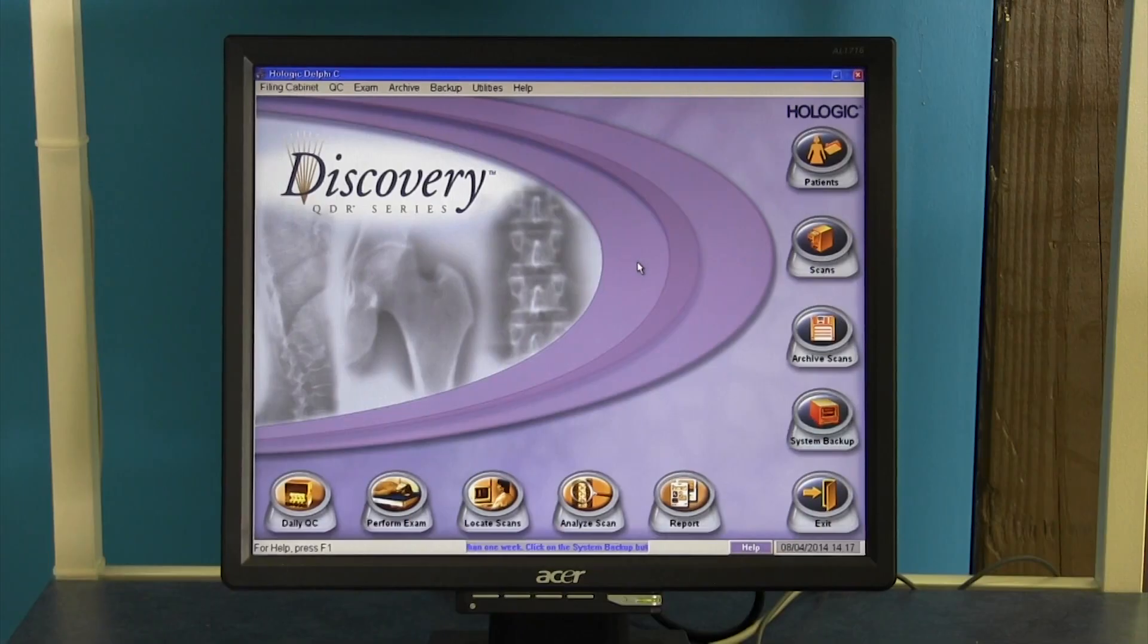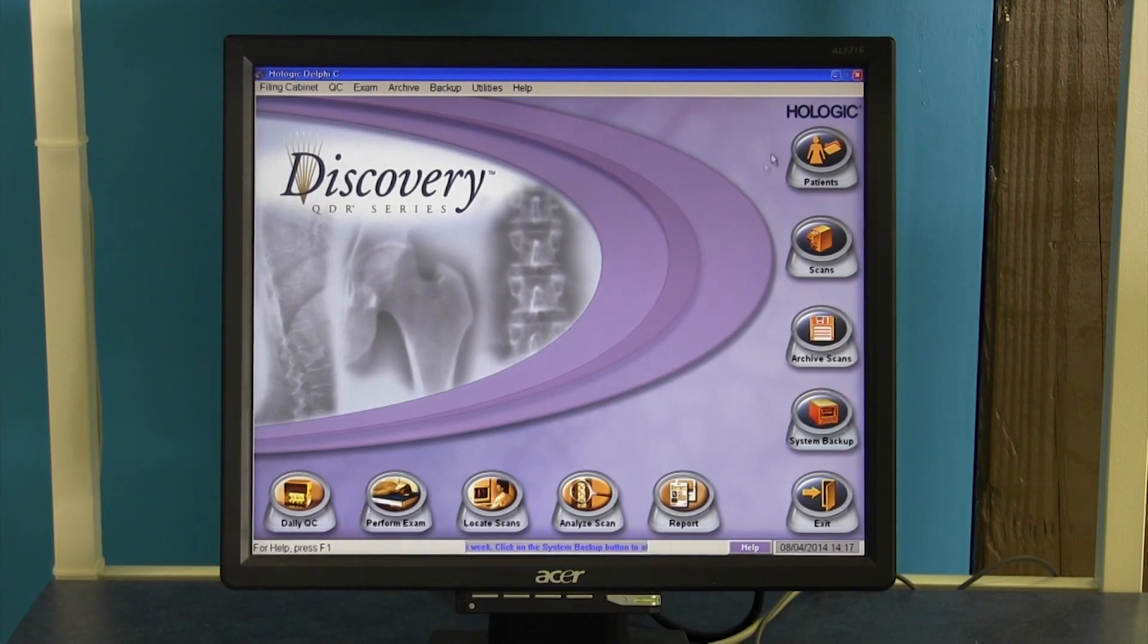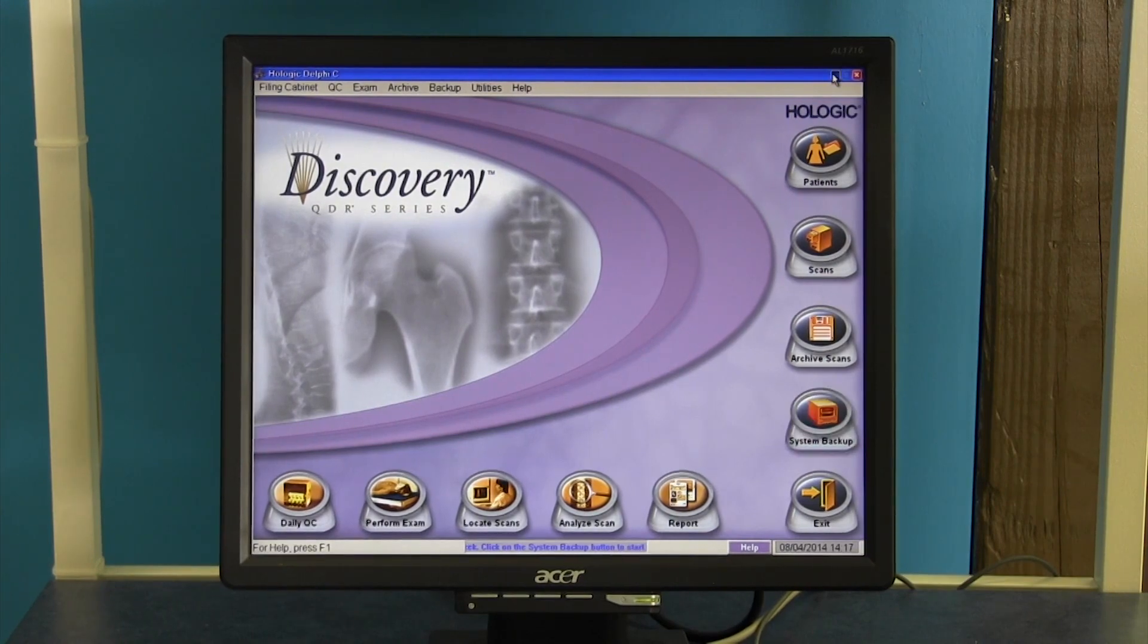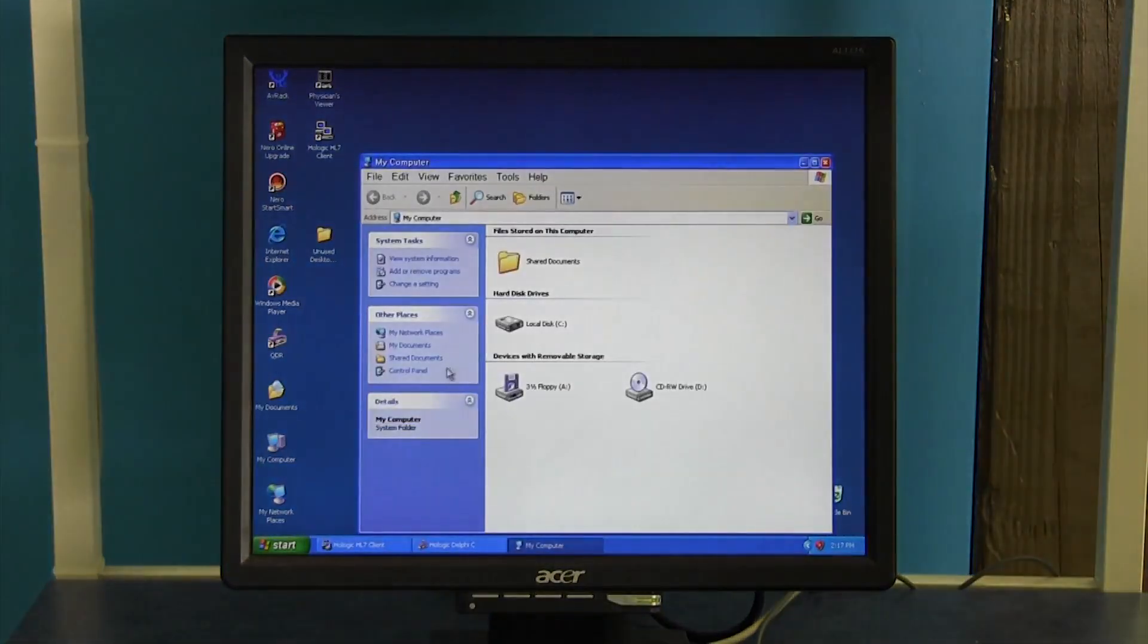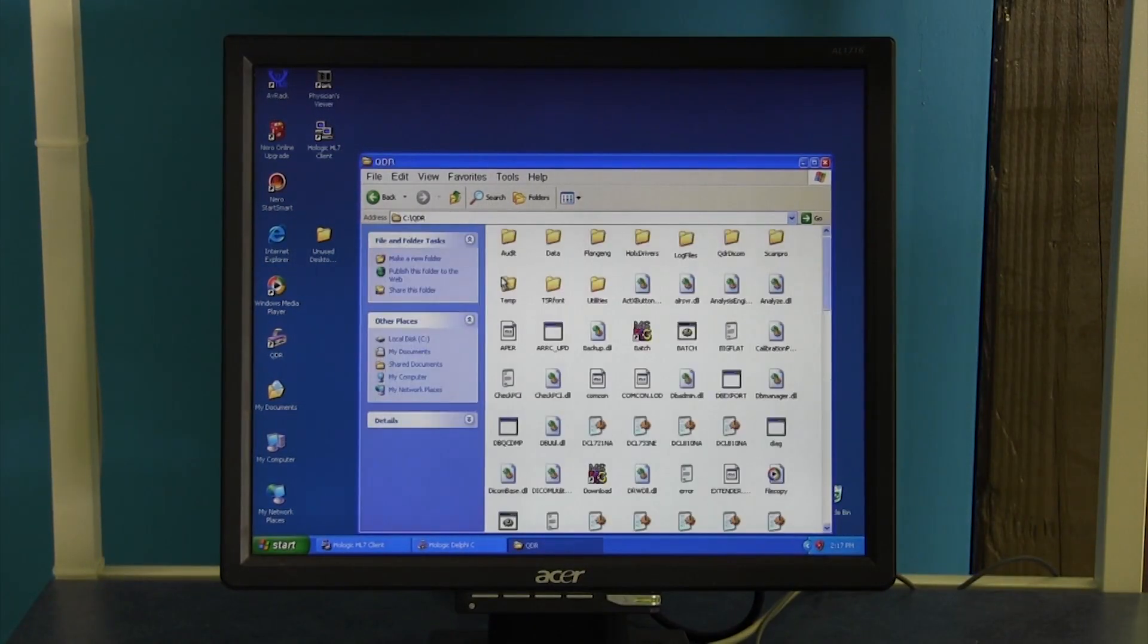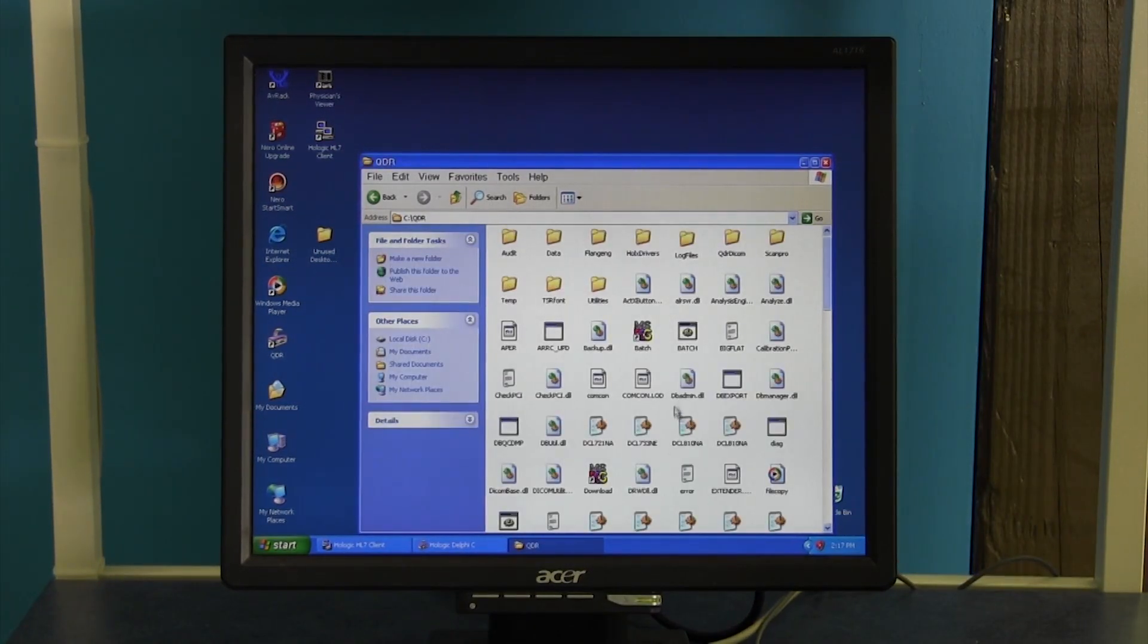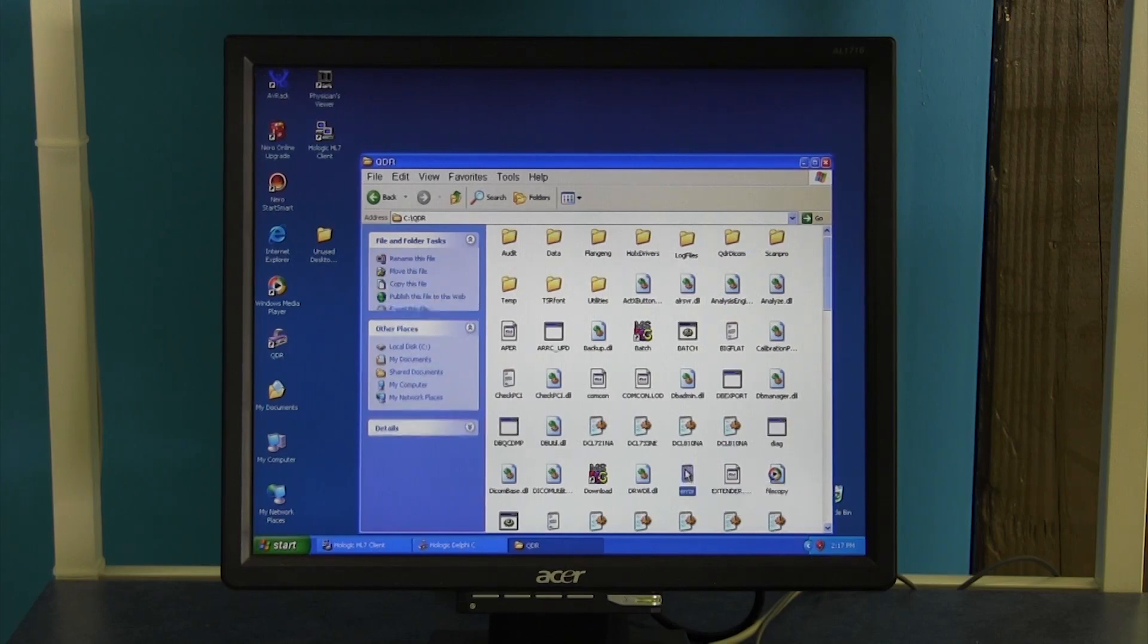Finding your error logs is quite easy. Minimize your discovery software, go to my computer, click on your local C drive, and get into your QDR folder. From there you're looking for an error.txt file.